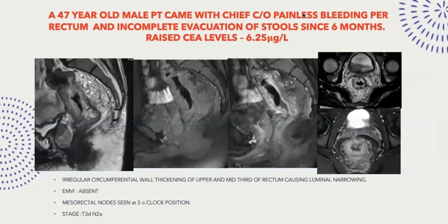A 47-year-old male patient presented with painless bleeding per rectum and incomplete evacuation of stools since six months. Lab results show raised CEA levels. MRI shows irregular circumferential wall thickening of the upper and mid-third of the rectum causing luminal narrowing. There is no extramural vascular invasion. However, the mesorectal fascia is involved and nodes are seen in the five o'clock position. It is staged as T3B N2A.